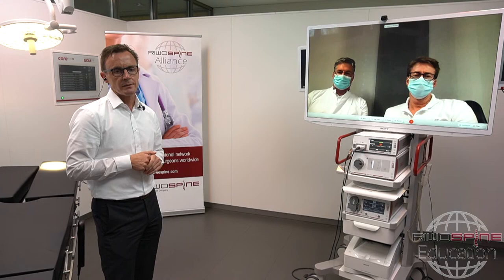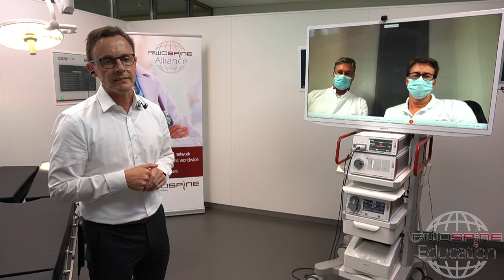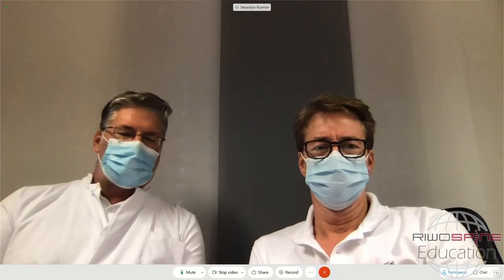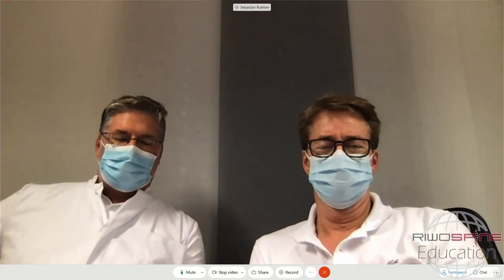Another question is about the size of the working channel of the anterior cervical system. Dr. Komp, are you, or? Well, in fact, you know the millimeters much better than me. In fact, it's a special system due to the situation that we insert the endoscope in a small working tube, and there we have the possibility to work in. So we work beside the endoscope. We don't have an intraendoscopic working channel for that. This is due to the situation that we really have very small, just some millimeters where we can work in with a whole system.